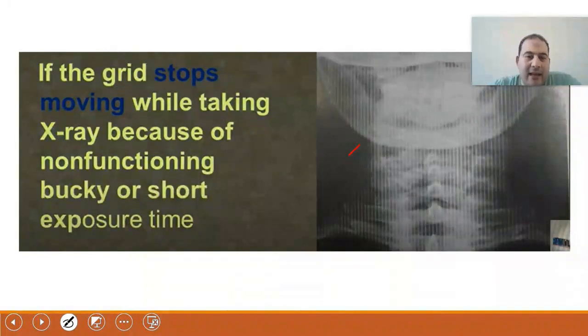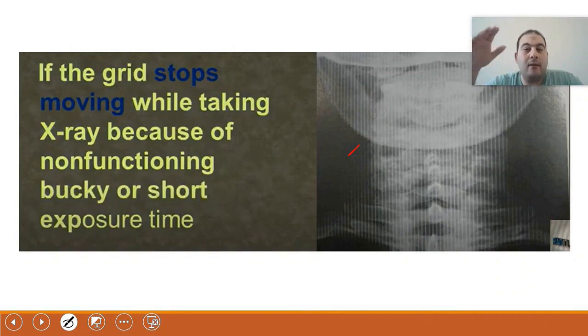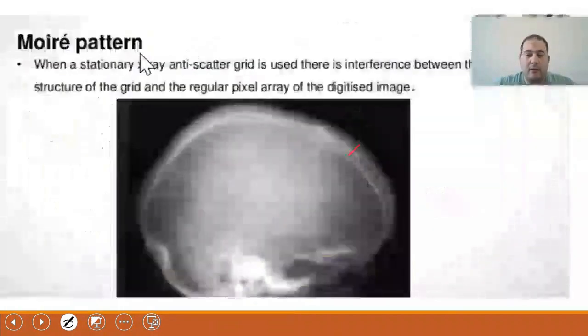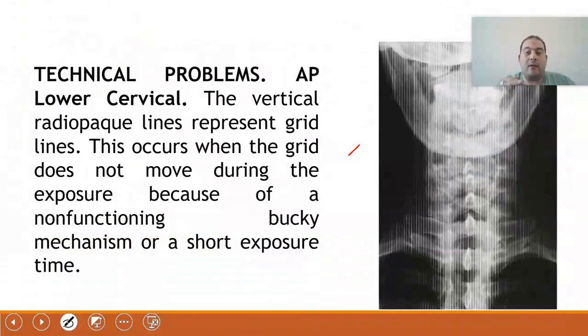Are you asking if this happens in dynamic imaging? No. The situation here is different. There has been a shift in the grid itself. This is what I am talking about, focusing only on the grid. The grid itself has shifted, so the design of the imaging has changed. Do you understand? If you are getting your view, this is different.